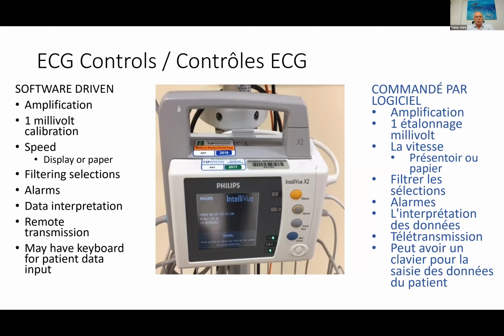And of course, you also would have some type of transmission if you're going to be sending the signal to a central location, a nurse's station, or to the network. You may also have a keyboard for patient input.